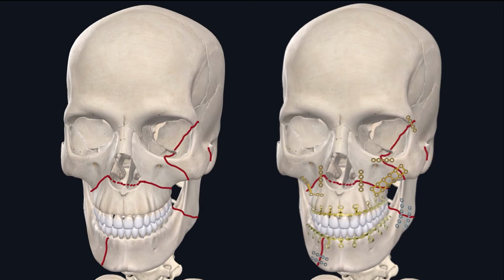Historically, people have discussed performing it top down, bottom up, inside out, or outside in. But in reality, I think the best approach is doing it from the easy to hard, meaning start out with your easiest fracture, plate it, and then move on to your next fracture. The reason for this is that if you plate a fracture incorrectly, that error will be compounded as you move towards your next fracture. So it's imperative to start out with the easiest fracture and get that reduced and plated with minimal error as possible to avoid compounding error throughout the rest of the fracture segments.